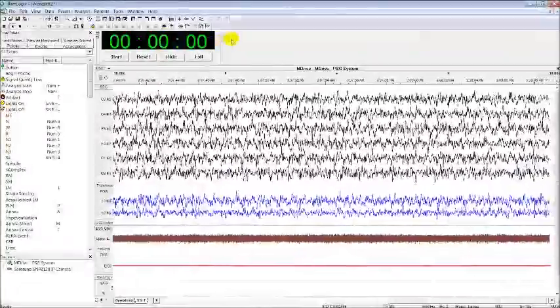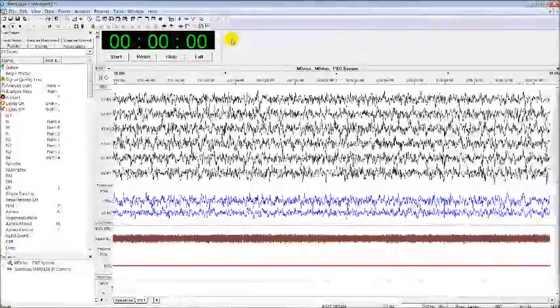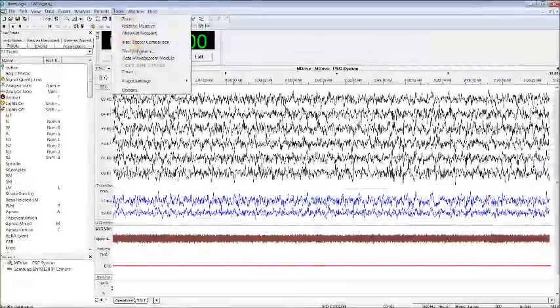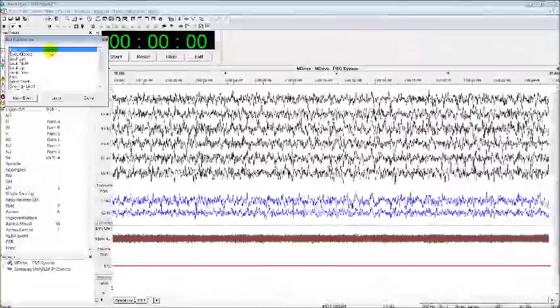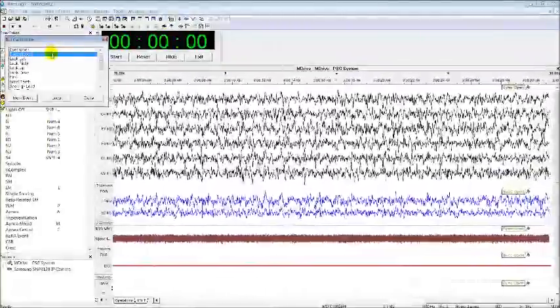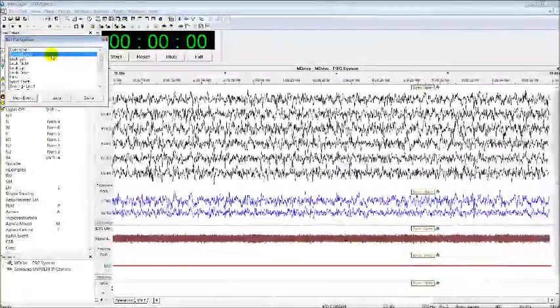Okay, let's start now. Let's say the patient is already on the bed, and now we will start with the biocal. I'll go to tools, biocalibration. I will first ask the patient to keep his eyes open for 30 seconds. I'll click here. Let's say after the 30 seconds, I'll ask the patient to close his eyes for 30 seconds.